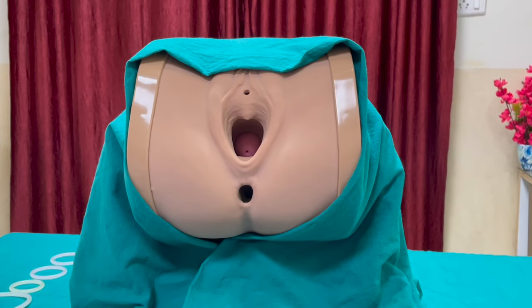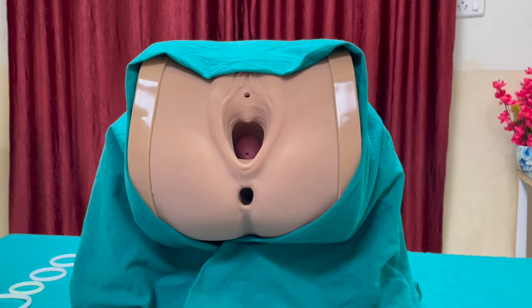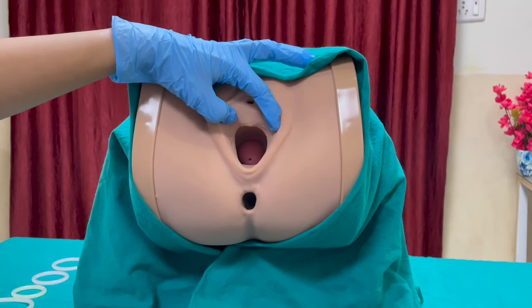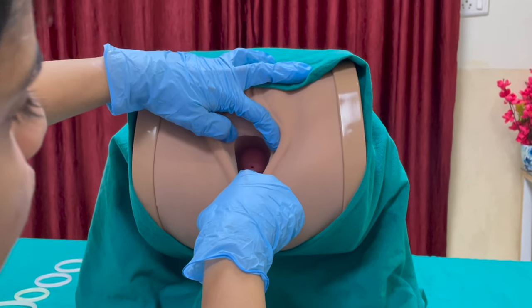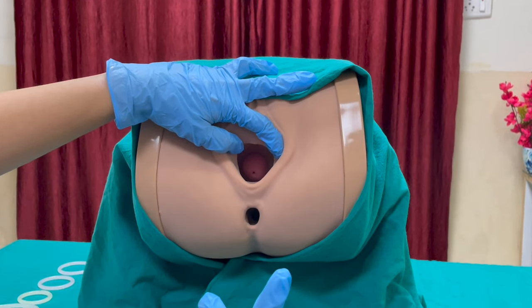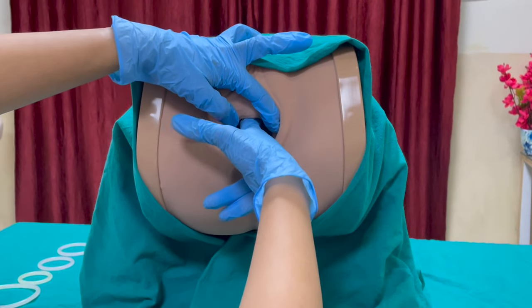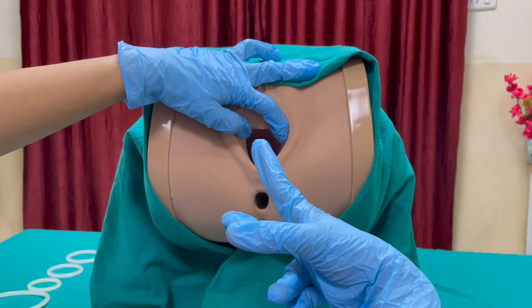After examining the patient with an empty bladder in the dorsal lithotomy position and assessing the grade of pelvic organ prolapse, we assess the size of the pessary to use. Use the non-dominant hand to separate the labia, open the introitus, and gently press in the perineal body to visualize the prolapse and cervix. Then with the dominant hand, use the middle finger and index finger to assess the size — the middle finger goes behind the cervix and the index finger goes behind the pubic symphysis.